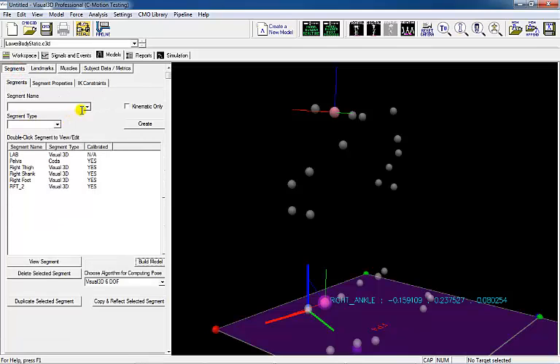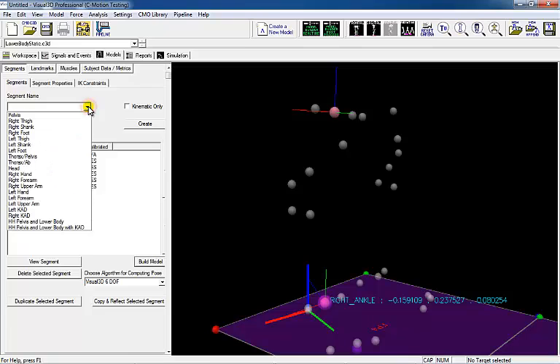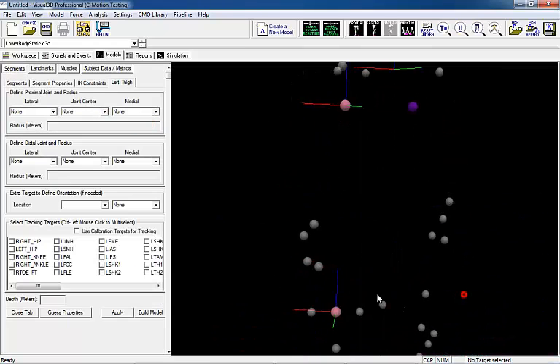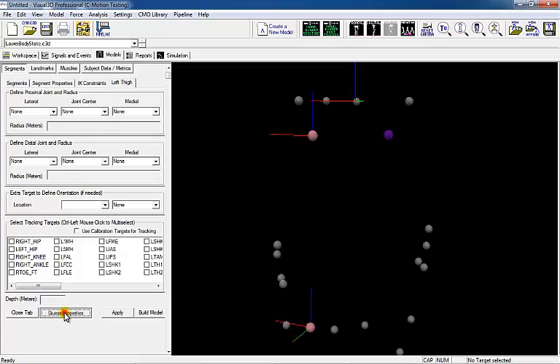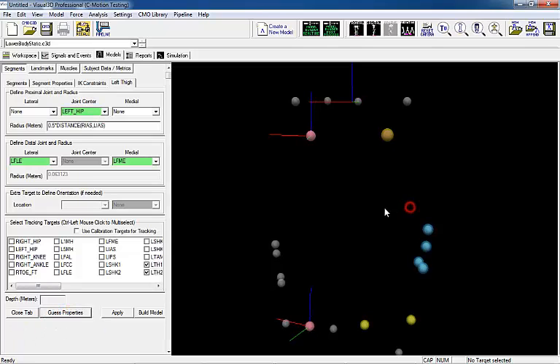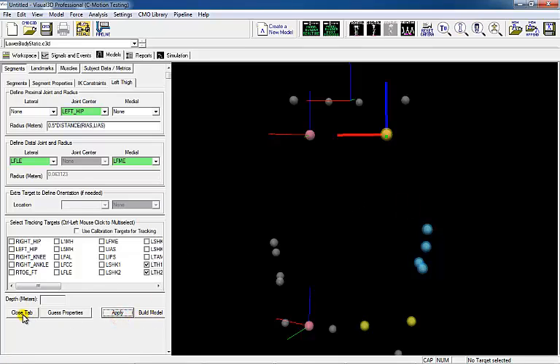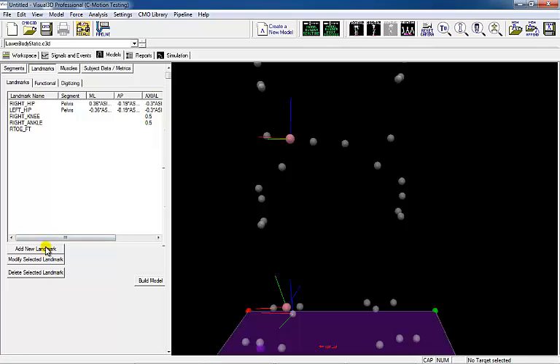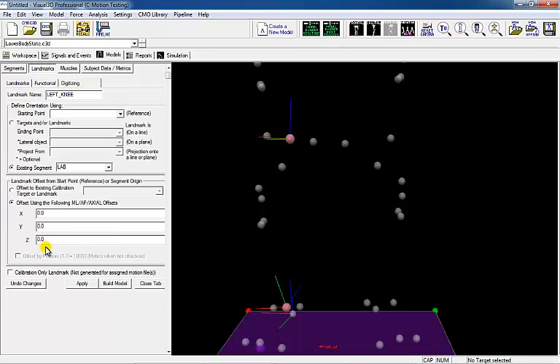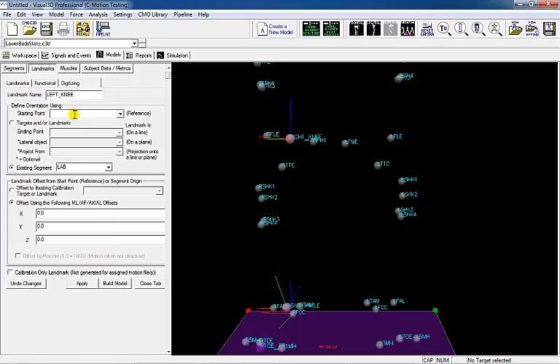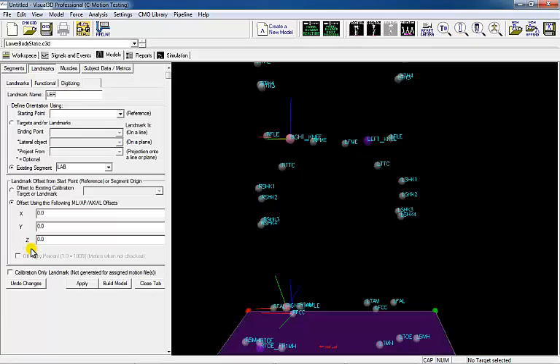Since the right thigh has been created, the Guess Properties button can be used to create the left thigh. Once the button has been pressed, Visual 3D will auto-populate the segment identifications. After creating the segment, check that the distal and proximal ends of the segment, as well as tracking markers, have been identified correctly. Since the shank and foot segments are created off user-identified landmarks, these landmarks will need to be identified before the segments can be created. The left knee target should be along the line of the medial lateral knee targets, placed halfway along this line and only used for calibration. The left ankle target should be along the line of the medial lateral ankle targets, placed halfway along this line and only used for calibration.